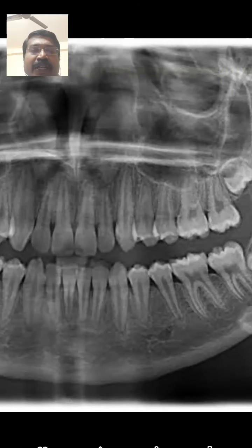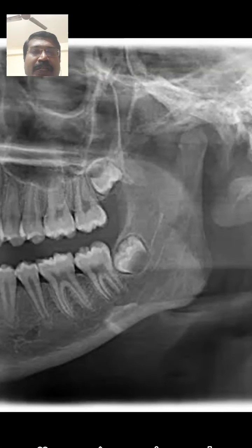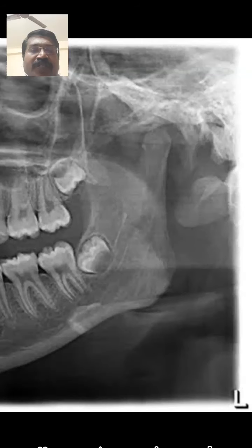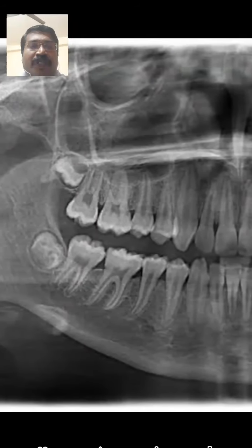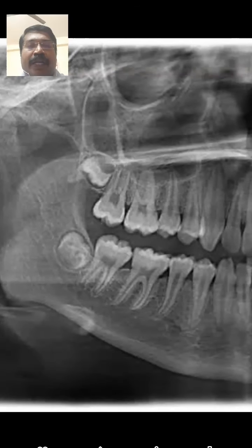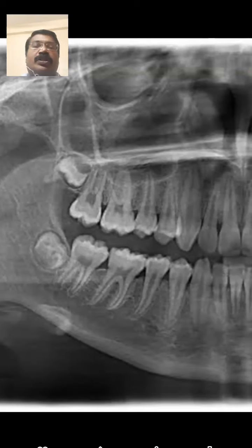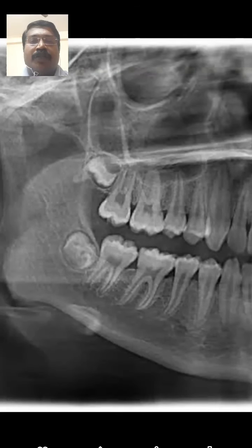The same thing we can do on the left side of the maxillary bone. Then we can see the zygomatic process of maxilla and any alterations or fractures of the zygomatic arch. Then we can move on to the orbit, left and the right side, any alterations or any pathological fractures or any pathologies in the orbital rim, floor of the orbit and the superior surface.